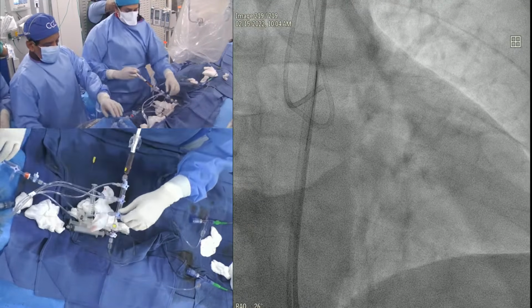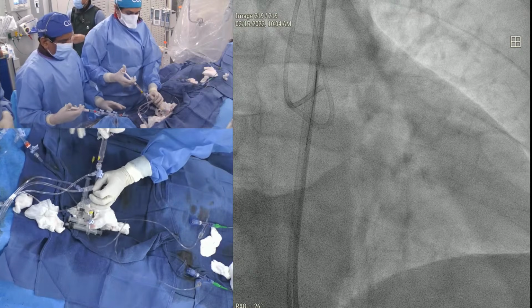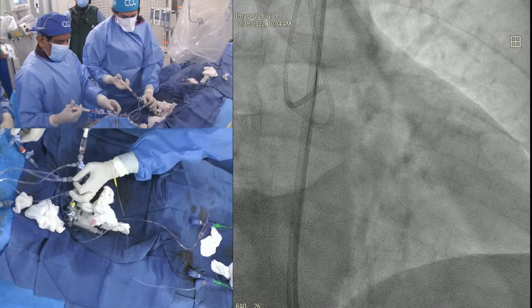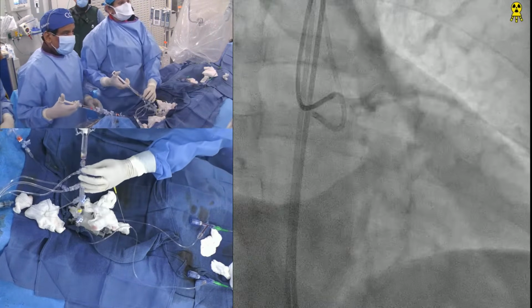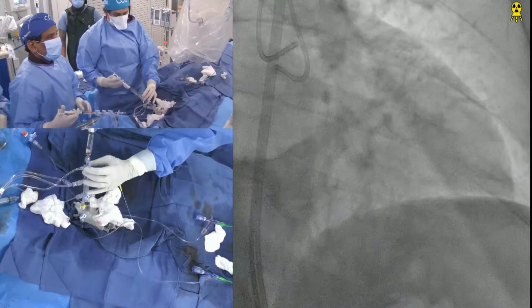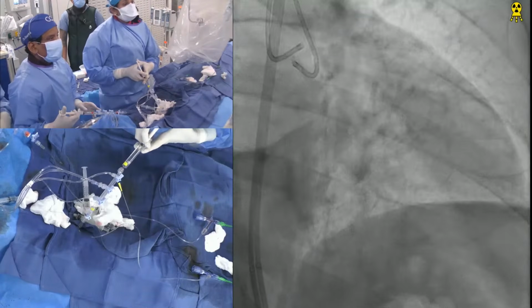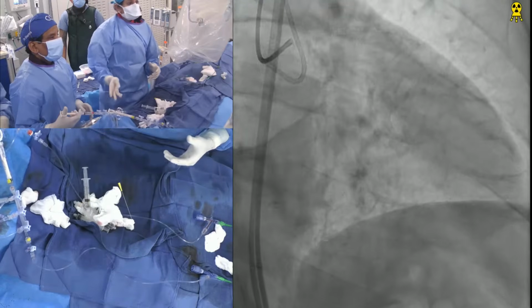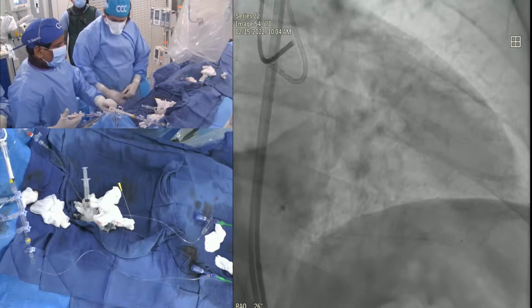Okay. So plans for this patient, plans for any management: we'll bring him back in three months time, this young guy. We definitely will bring him back. Always document that your left system is okay. Biggest thing is dissection, thrombus formation. Left system only now. Okay, looks good. Collaterals still remain good. Okay, good. We stop it here.